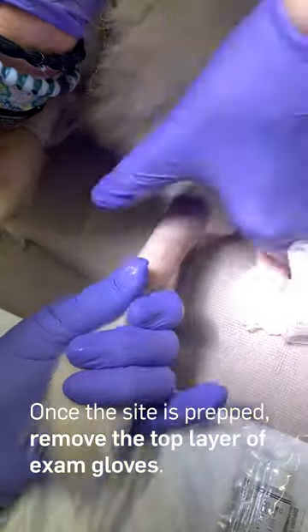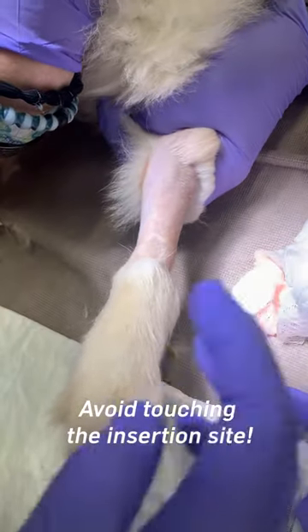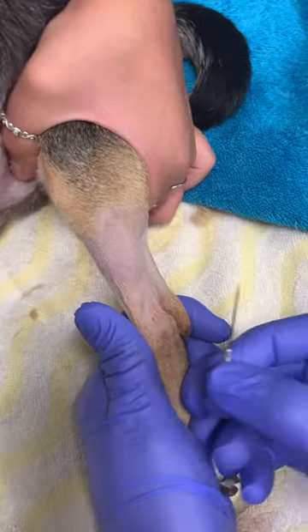Once the site has been aseptically prepped, adequately remove the top layer of exam gloves. Avoid touching the insertion site once it is thoroughly prepped, as this contaminates the freshly prepped site.